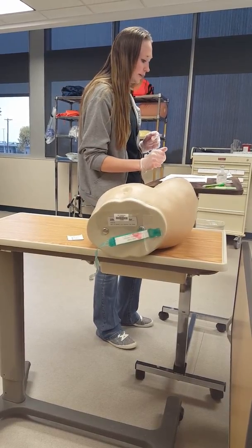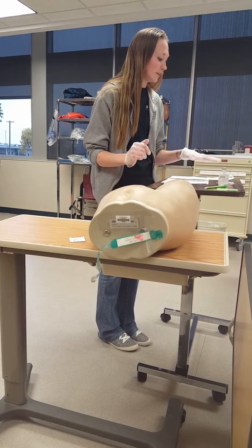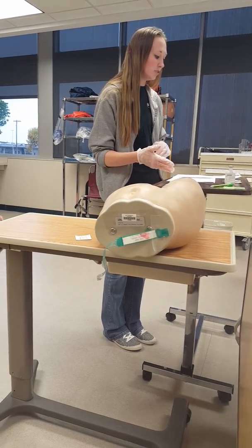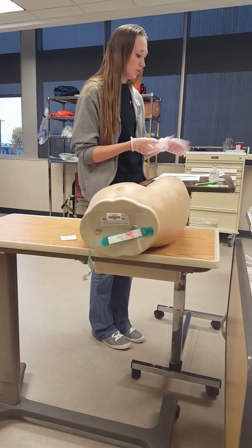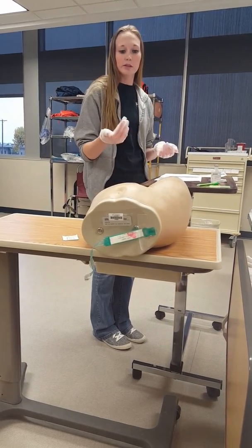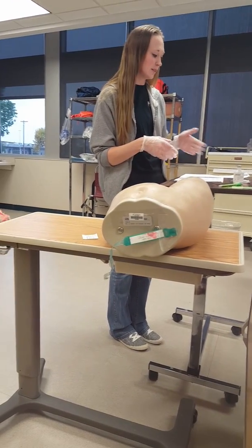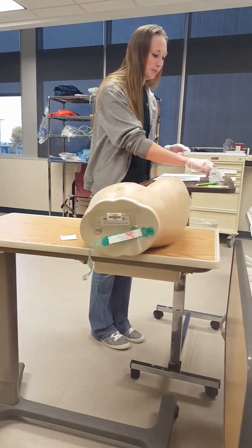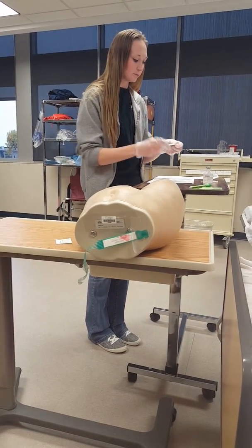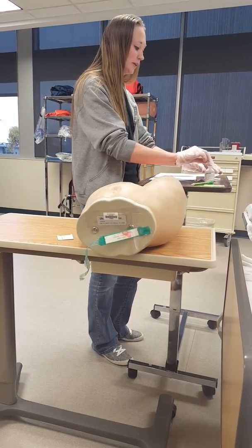And then next thing I'm going to do is, for the needle, I'm going to use a 22 gauge by 1.5 inch needle. And I'm going to use this because you're a pretty good shape person and you're not bigger. So we have sites that are smaller and bigger. So I'm going to be using that. So I'm going to clean my vial. And I would do this for 30 seconds, but for the sake of the video, I will not be doing that.